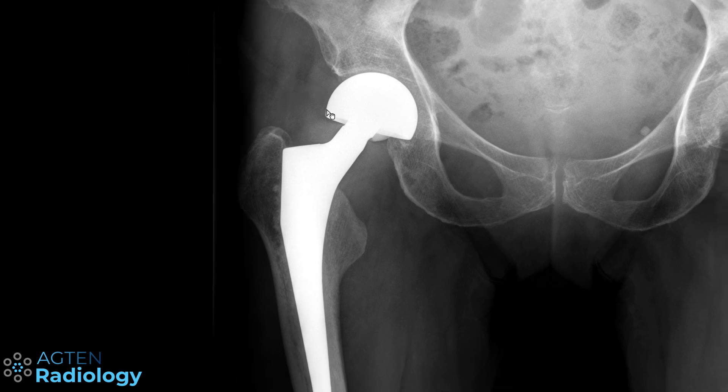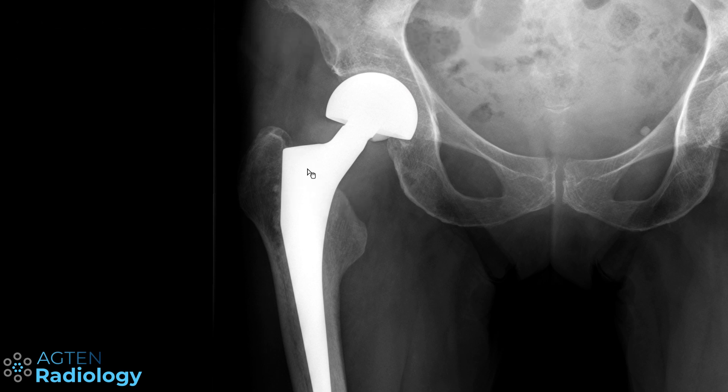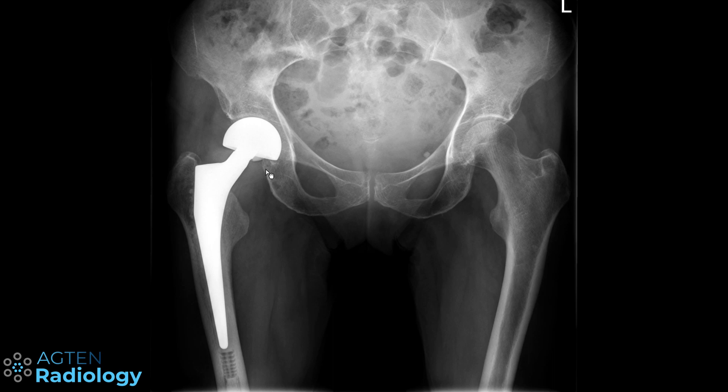It's not a total hip arthroplasty because they did not replace the acetabular side of the joint. This is a bipolar hemiarthroplasty, meaning they just resected the neck and the femoral head after a fracture, as we can see here. The patient sustained a fracture of the femoral neck, and because the joint itself is quite okay — no osteoarthritis or anything — there is no need to necessarily replace the acetabular side. So they take out the fragmented head, cut off the rest of the neck, and put in a hemiarthroplasty.